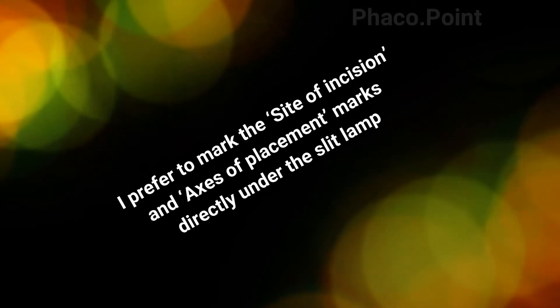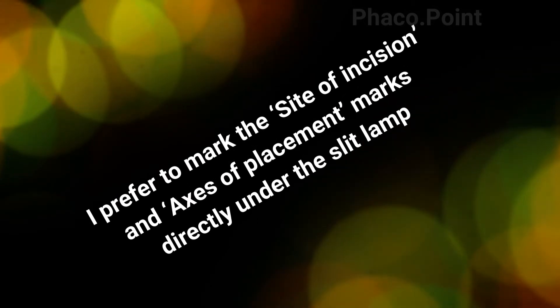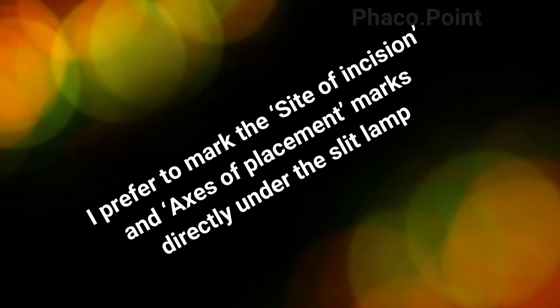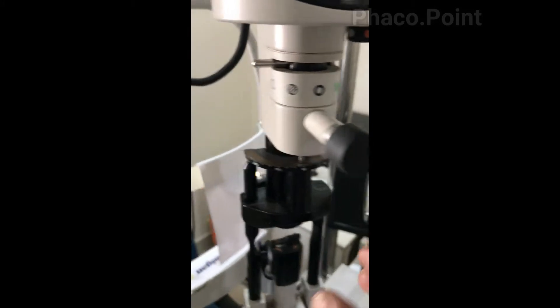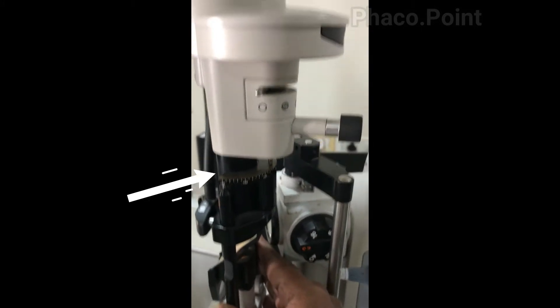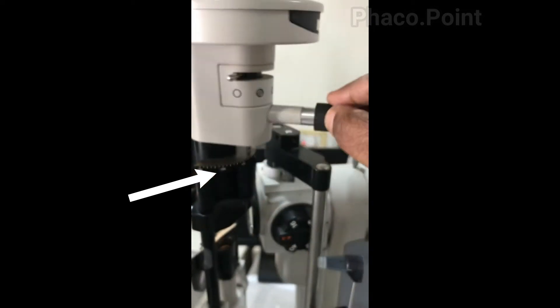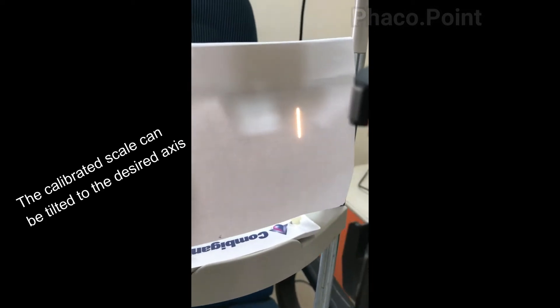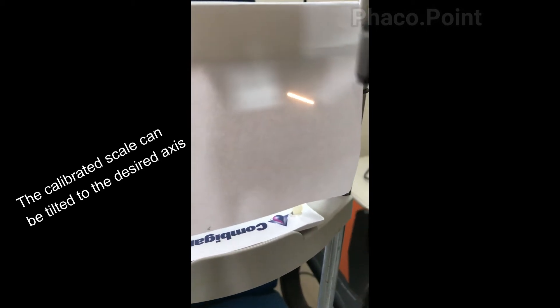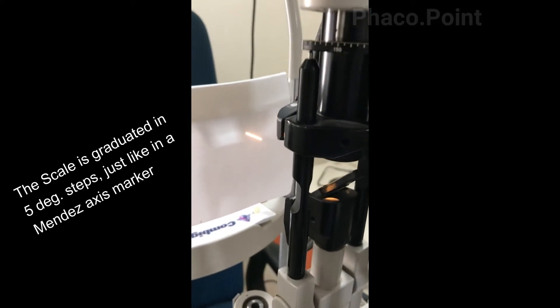Hence, what I do today is mark both the site of incision and the placement axis markings directly under the slit lamp. There is a graduated scale in the slit lamp that enables us to turn the angulation of the slit beam to our desired axis simply by rotating this graduated scale. It is graduated in 5 degree steps and is as sensitive as the Mendez axis marker, which is also graduated in 5 degree steps.